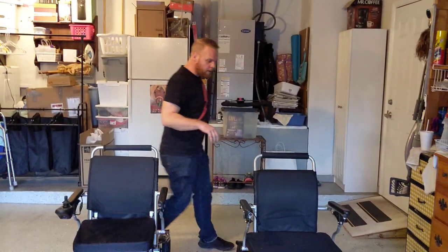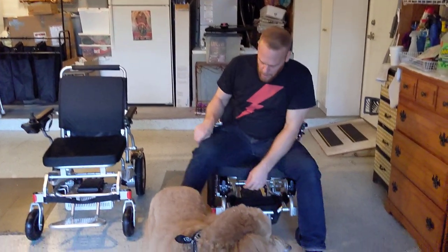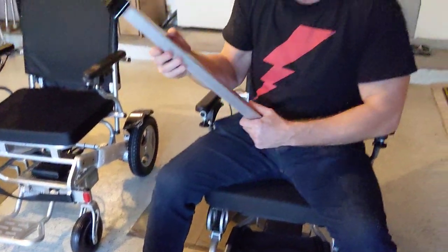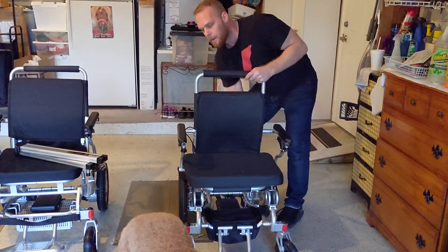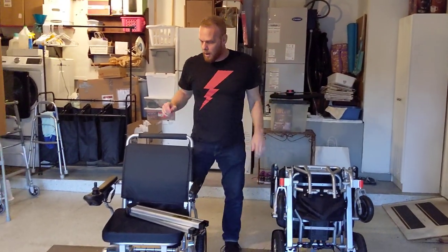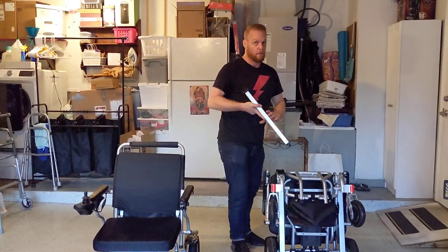Now let's go ahead and get the batteries out of the Electro 7. I'm going to sit in this chair — there's a little knob behind each battery. I press it — there's one battery out. I press behind the other battery — there's the other battery out. The joystick is already off the chair and I'm just going to go ahead and fold this up — and there we go, done.